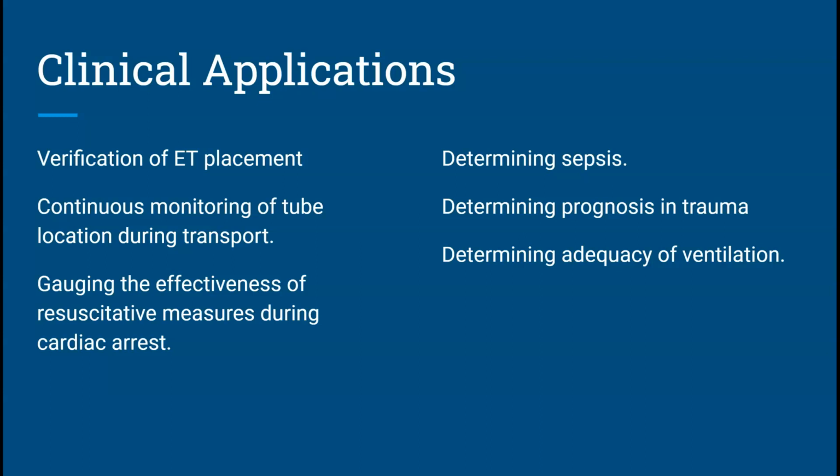You also notice that if you have a patient who's in cardiac arrest, if they achieve ROSC, their end tidal will suddenly spike. This is very commonly due to the fact that now they're perfusing much better, right? The heart started working again. It's getting that blood around the body more effectively, which means it's bringing more carbon dioxide back to the lungs for exchange. You will also see this after you give a patient sodium bicarbonate. Okay, you'll see the end tidal will commonly spike, even if you don't have the patient back. That buffer helps promote getting that acid out of the system a little bit better.